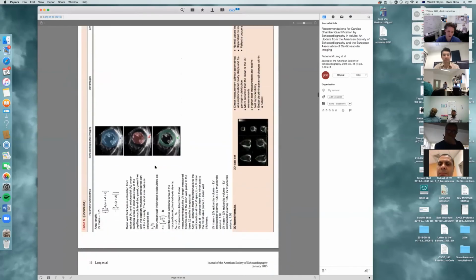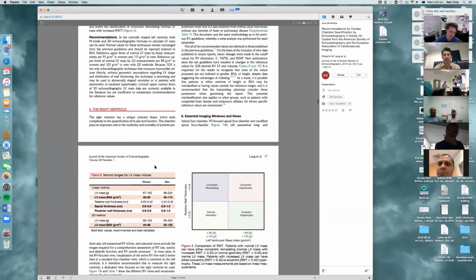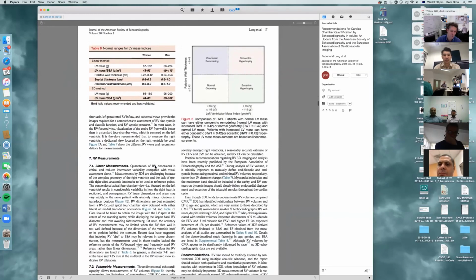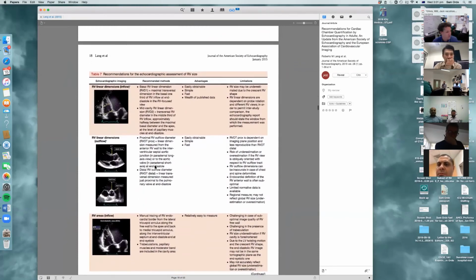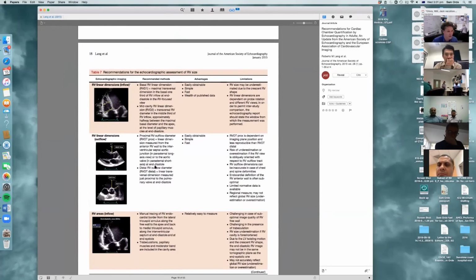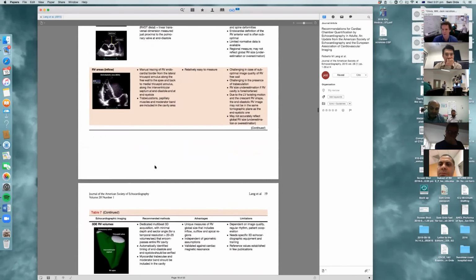You know what's going to make things easier? Louise, the definition of hypokinesis in Benita Anderson's book says 40. We had someone else saying 30. I was saying 50 as per the guidelines. What do you think of the definition of hypokinesis? 50. There we go. What does Benita know? I've got Louise Smith. Exactly. Yeah.